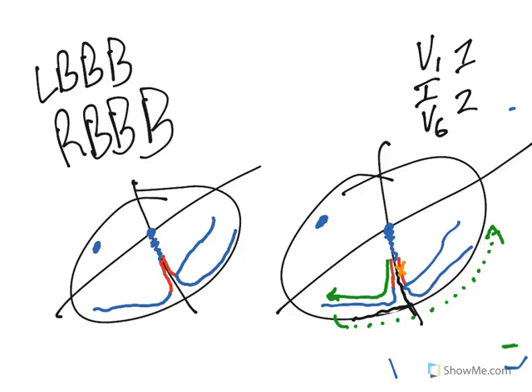And so we know that when we're looking at our EKG, the lines go this way and this way. Between the horizontal lines, we're measuring energy, right? We're measuring millivolts. But from point to point on the EKG, let me erase this real quick, from point to point, I would be measuring time.